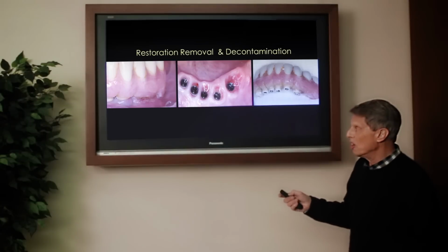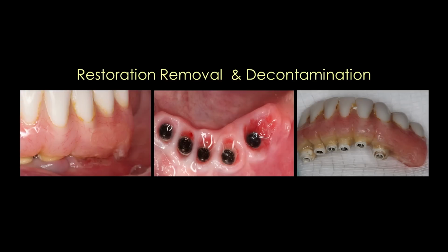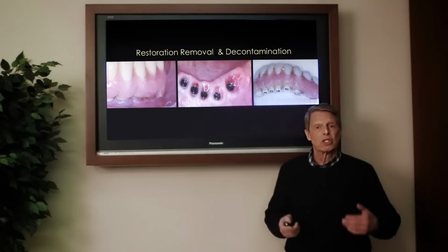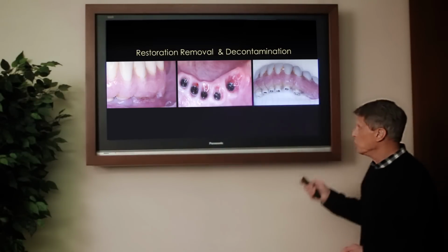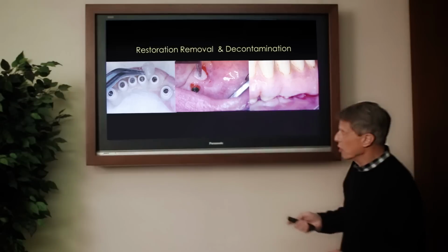Here's another case underneath the framework of an implant. This patient came in with a soft tissue abscess. She was unable to keep the area clean. We removed the framework and take a look at the inflammation around all of the implants, even where there wasn't an abscess. So what we subsequently did is we wound up cleaning the underside of this implant very thoroughly.